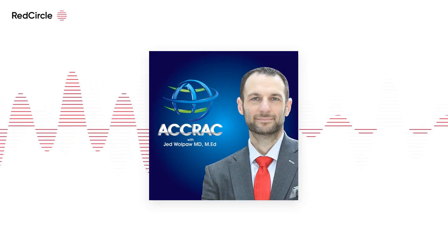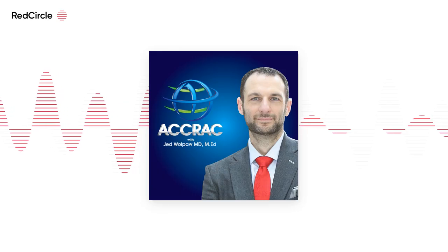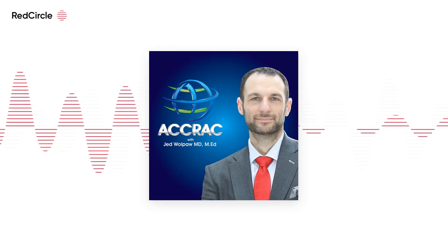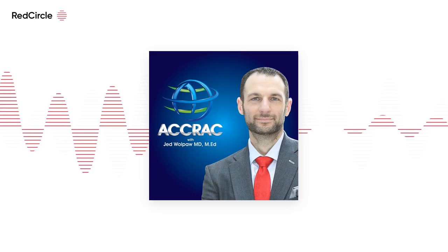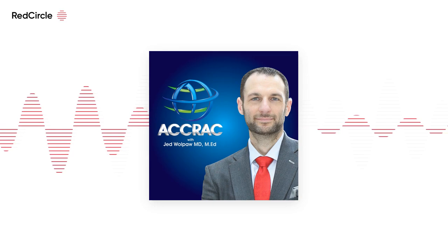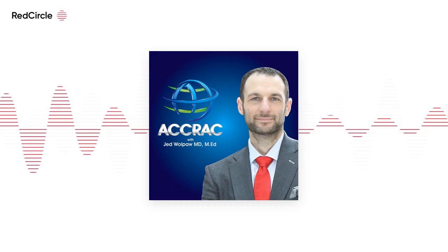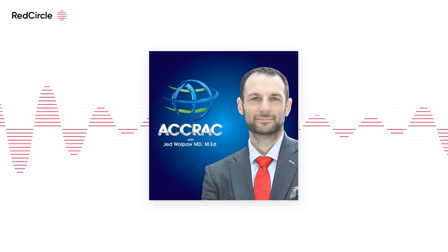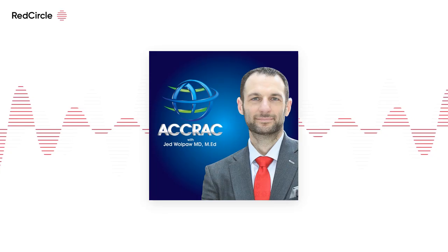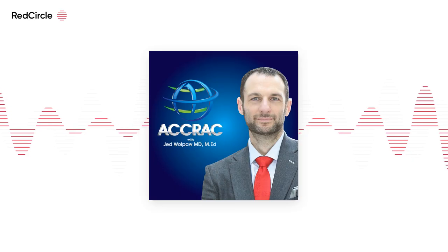If you're using pressure control during your decremental PEEP trial, then essentially you have a fixed dynamic driving pressure. Your static driving pressure may change as you come down, but typically you're just monitoring respiratory system compliance, either as measured by the ventilator or you're looking at tidal volume because your pressure is not changing. If you are using volume assist control, then because your volume is not changing, you could just use driving pressure, because the only part of the compliance equation that would be changing would be plateau pressure minus PEEP. So you could look at driving pressure at each stage.